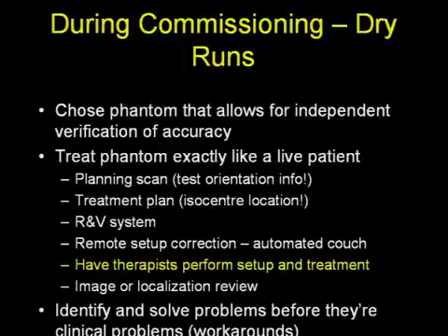One would also be well advised to test at this time the remote couch setup, and make sure that it works accurately. And it's also at this time that you should have therapists get involved and perform the setup and treatment of the phantom, so that they're part of the dry run tests from the get-go, and they get to learn, again in a multidisciplinary environment with the guidance of physics, how to optimize a clinical process.